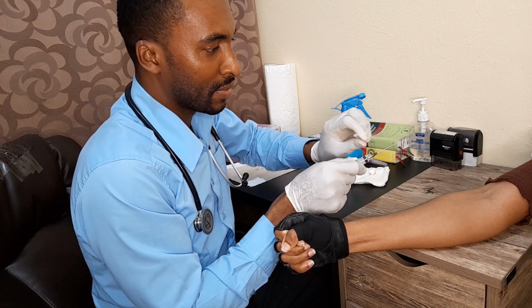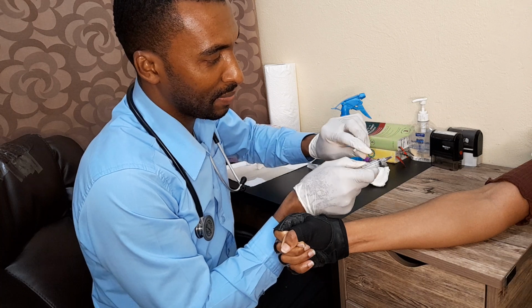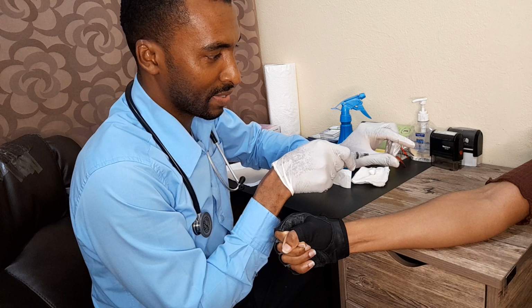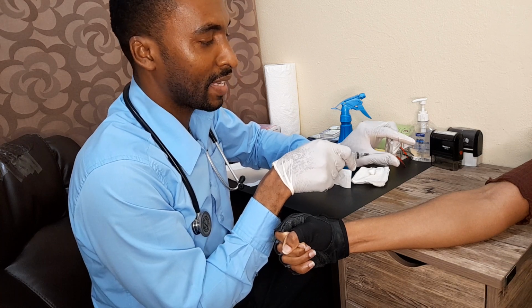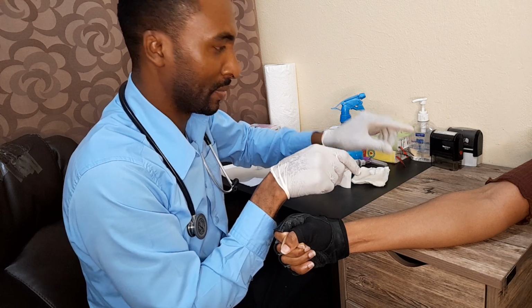So it's good to know that when I pull this cap, when the bevel is up, I'm seeing the numbers here. So even when I'm in the person's skin, in the flesh, I can still know when the bevel is up without trying to guess whether it's up or down.